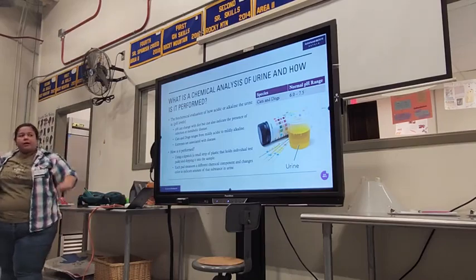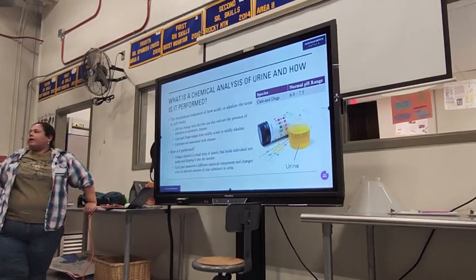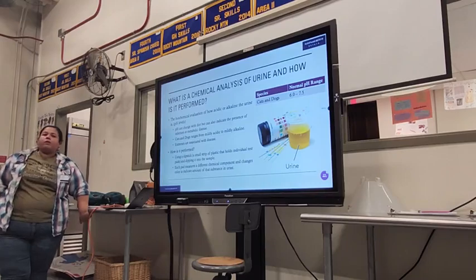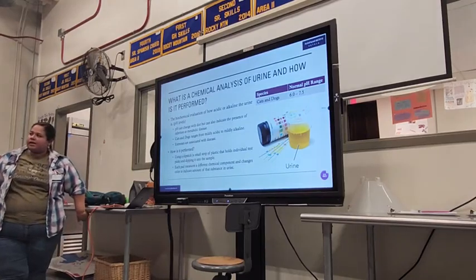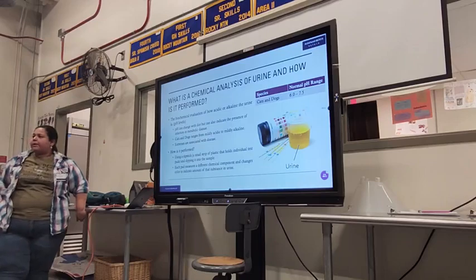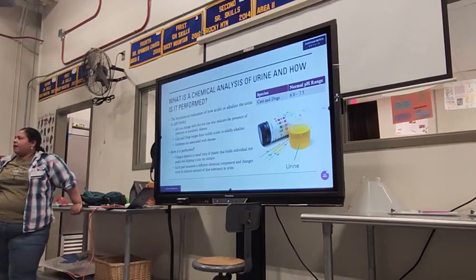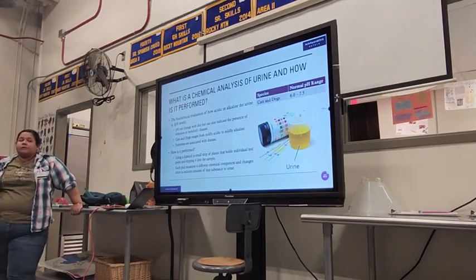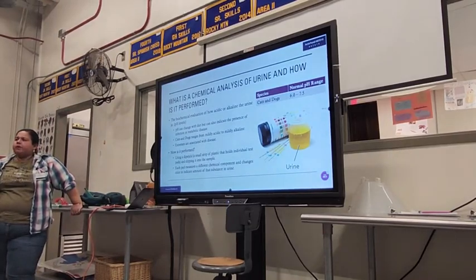Now here we have a picture of a cup, right? Let's say that's all the urine we have, and we have other tests we need to run. So we're not going to want to dip the stick in that particular cup. We're going to want to remove some of the urine, put it in a test tube, and then dip the stick in the test tube, okay? So try not to contaminate the sample that we have, or from further contamination, okay? Or a pipette. Typically, pipettes are in a sterile environment, or clean environment, right?